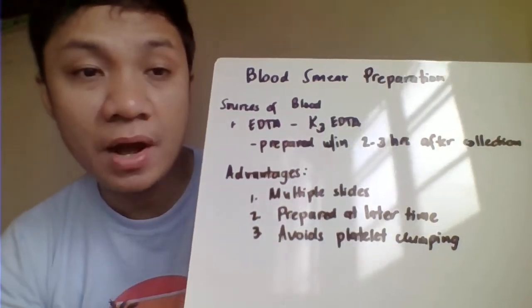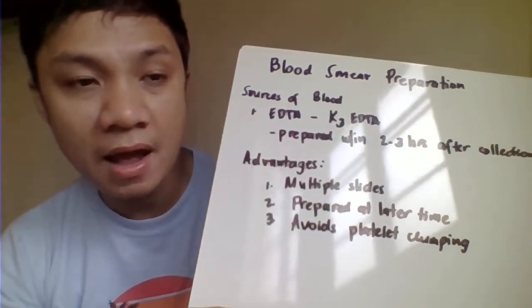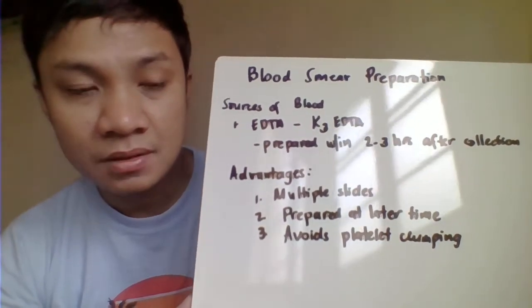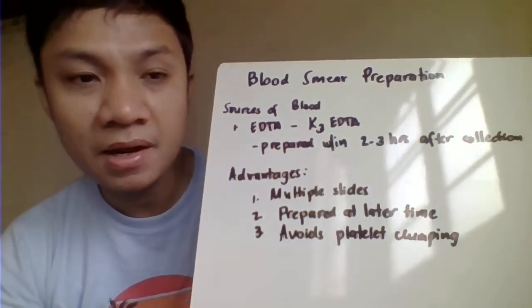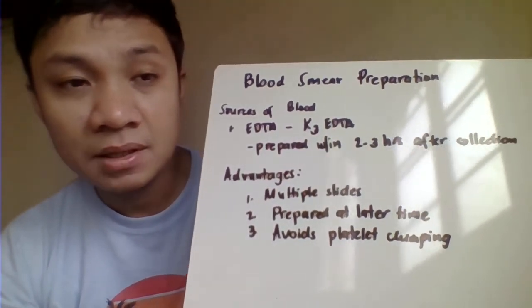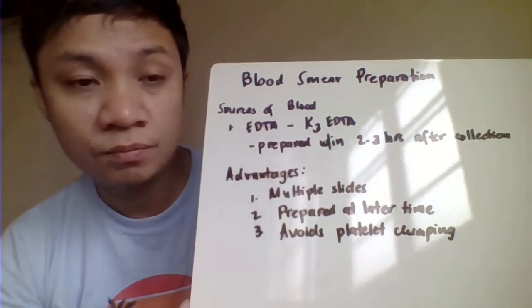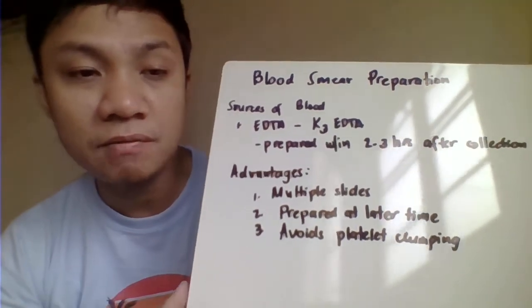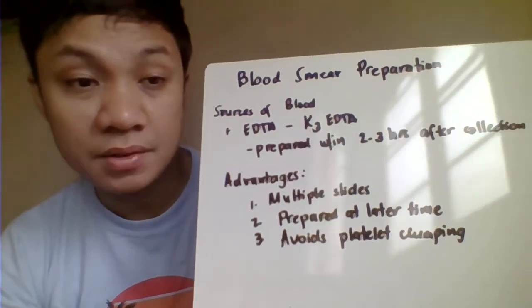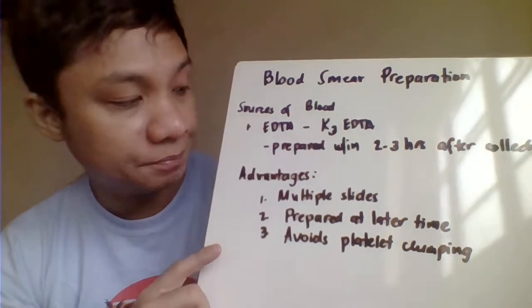Because of course, if it is more than 2 to 3 hours, most likely there will be some alteration in the morphology of your blood cells. When there is alteration, it might be interpreted as abnormal cells when you are doing the morphology evaluation. So to better preserve the morphology of the cells, you are required to prepare your blood smear within 2 to 3 hours of your blood collection with EDTA.